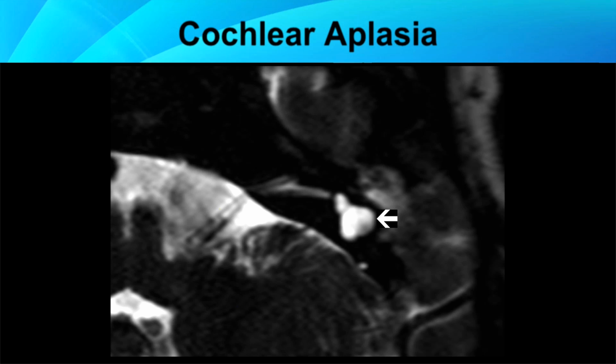If no contraindications to cochlear implantation are present, imaging is often utilized to identify anatomic details that would affect device selection. The size and morphology of the cochlea can help determine which electrode is best suited for an individual cochlear implant candidate. Some surgeons would select a shorter electrode for a shorter cochlear duct. Shorter electrodes are sometimes selected for individuals with severely dysplastic cochleae, for example in common cavity or hypoplastic cochleae. Some surgeons would choose one of the electrodes especially designed for a common cavity deformity when a common cavity is present.